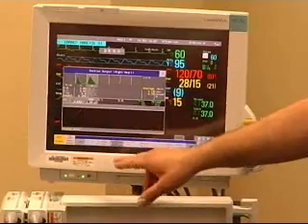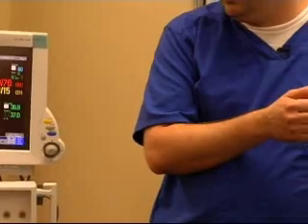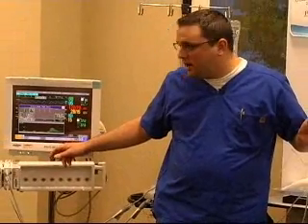So usually you're going to do about 3 of these, okay? 3 injections at least, and then you're going to take an average of that and get rid of 1, most likely. So this gives you an opportunity for error.